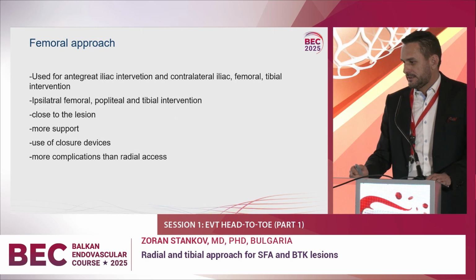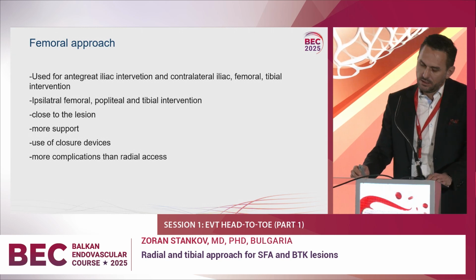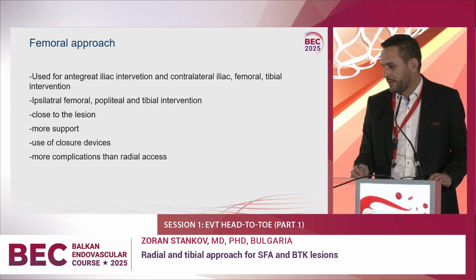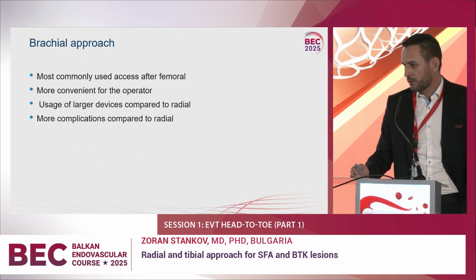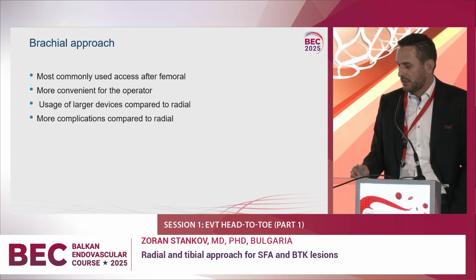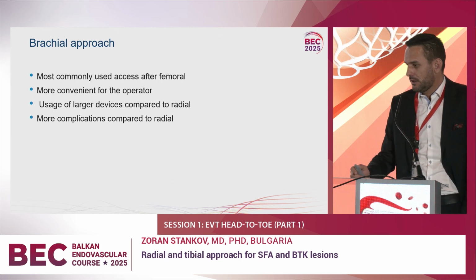But what is the situation compared to radial and femoral approach? The femoral approach still has more complications compared with the radial access. The brachial approach returned in the last year for total endovascular procedures.